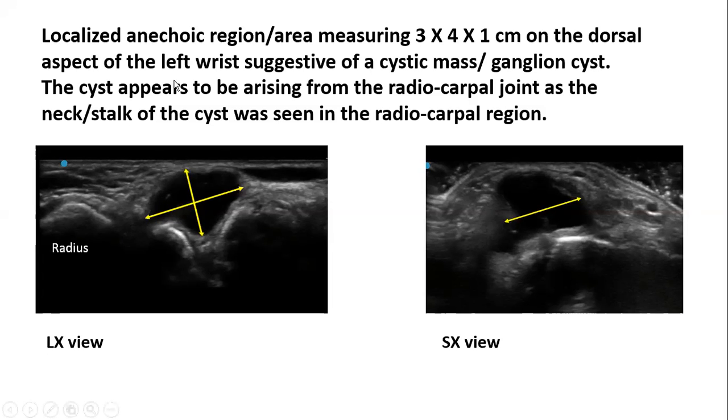Okay, and I have a question about that. Yep. The cystic mass, when it's cystic, it always has the posterior enhancement, correct? Yeah. Versus if it is a solid mass, it will not. No, there are exceptions. Don't confuse me. There are some solid masses which will give you some posterior enhancement. And that depends on the cell type. So if you remember your great case of schwannoma, yes, will show some posterior enhancement, and that's why it can be confused with cyst.